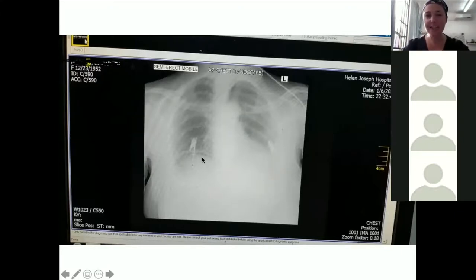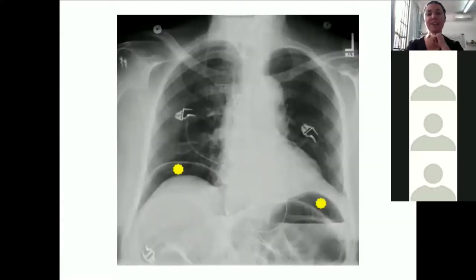So the fact that on this x-ray, you can see that there's a bit of gas below your diaphragm on the right-hand side, that's worrying. That means that you've got air underneath your diaphragm on the right that shouldn't be there. On your right-hand side, you should have a liver and you shouldn't see any air at all. So this is an example of free air under the diaphragm. Not the best x-ray, so I've got a slightly better version.